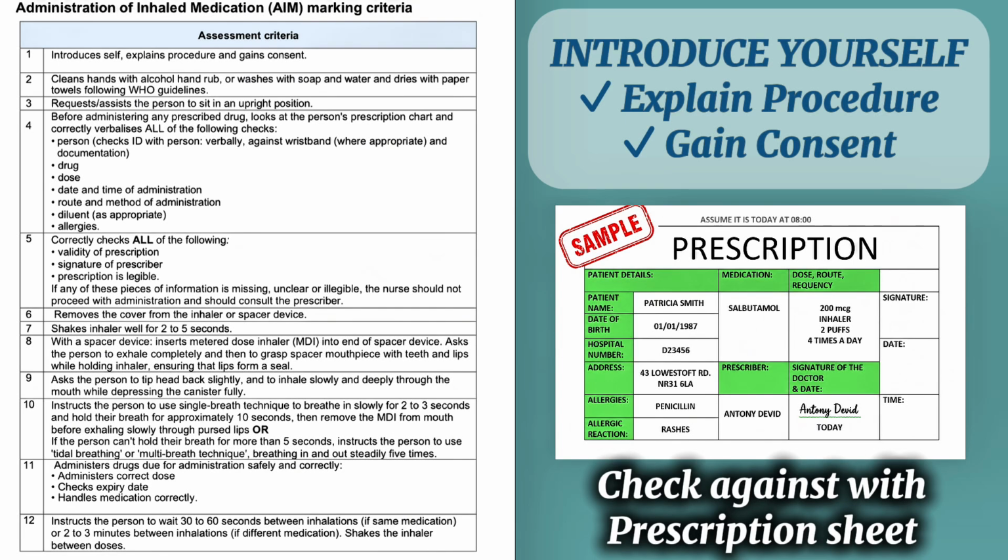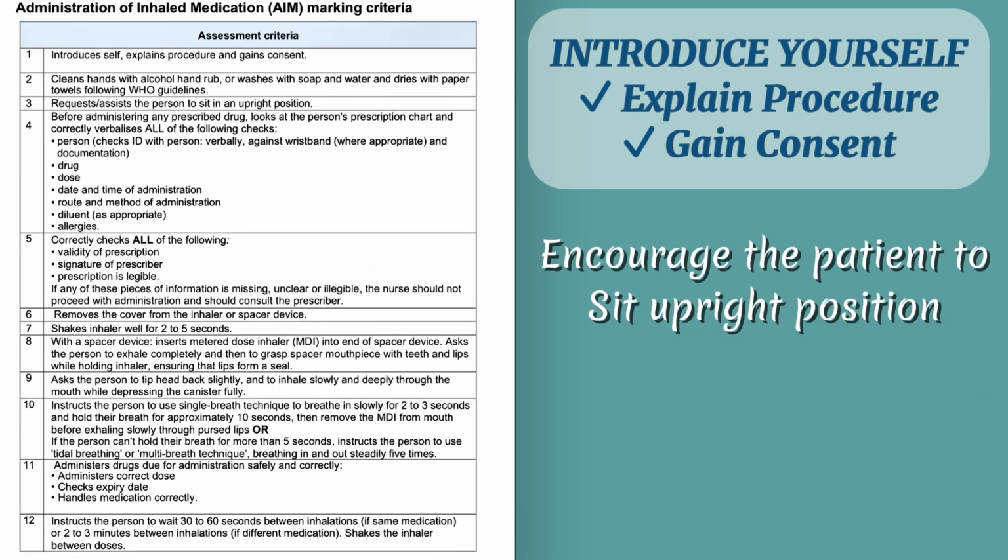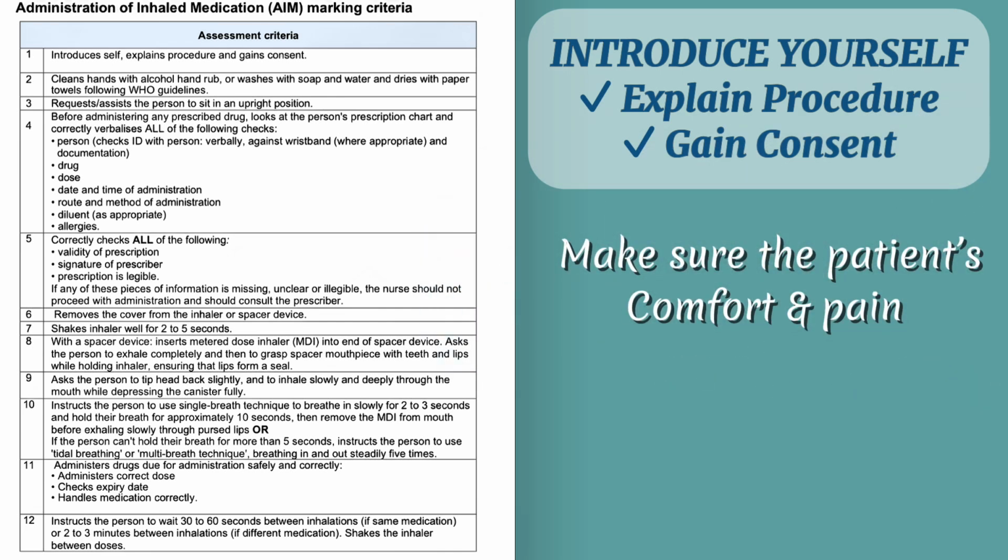Is that all right? Like I said, I will be administering your inhaled medication, which is salbutamol. I'm going to prepare all the articles that I need. If there is anything else, please just press this call button. Is that all right? I'm going to need you to remain in an upright sitting position. Is that all right? Are you comfortable?